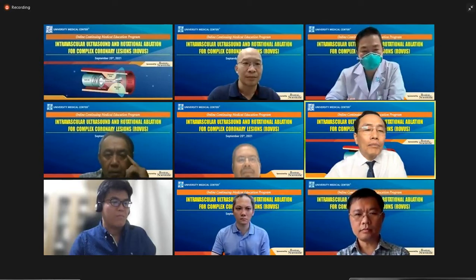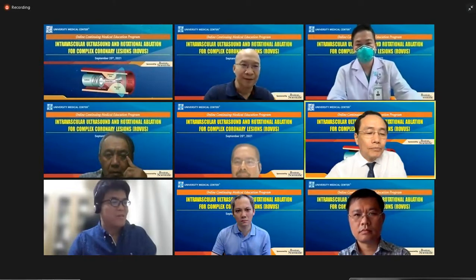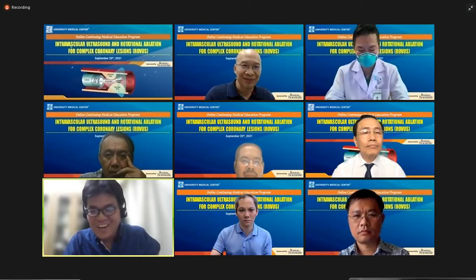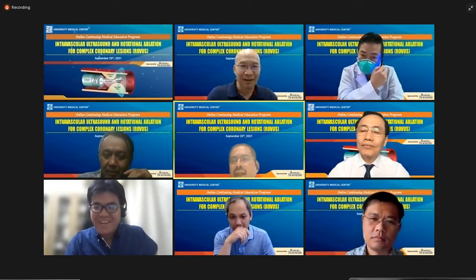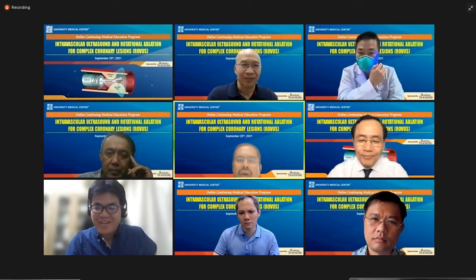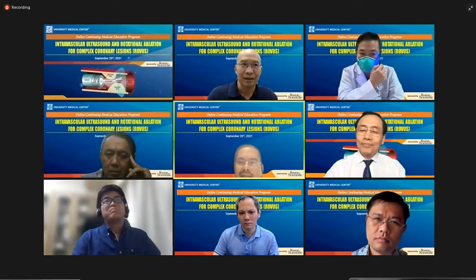Thank you, Professor Nguyễn Ngọc Quang. So, Dr. Kuramitsu, you have one question. May you answer this question? Thank you for your question. I'm sorry, I missed your question, so once again. Okay, Dr. Kuramitsu. Sometimes you see with the IVUS that the side branch is unlikely to occlude, but after you put in a stent, the side branch is occluded. What is the main reason for this kind of case?